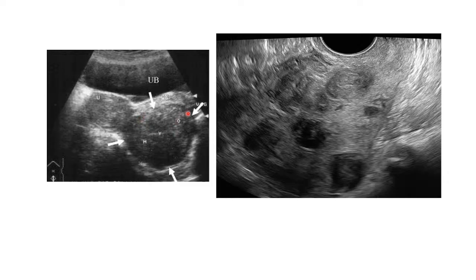So let's have a look here. You can see the uterus there, and you can see there is a fibroid there that is attached to this uterus. This is a huge pedunculated fibroid. There's a stalk, a connection between the fibroid itself and the uterus. Such fibroids are called pedunculated fibroids. Mostly they cause excruciating pain. Why?